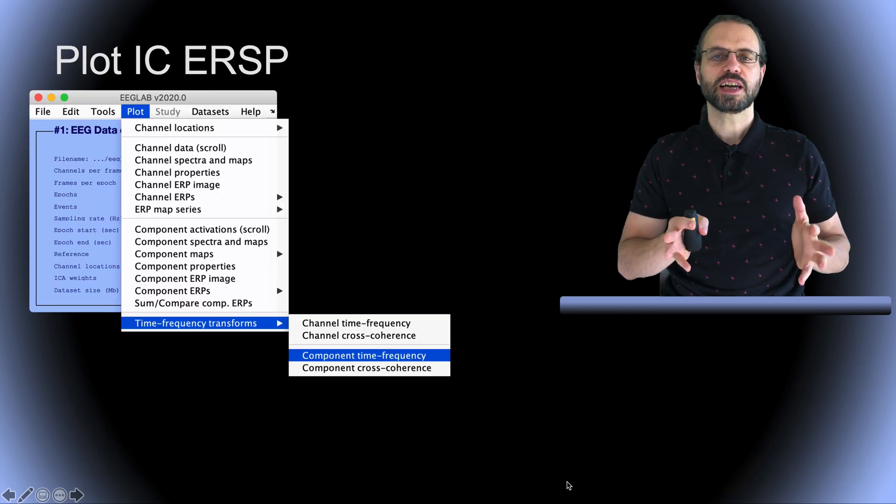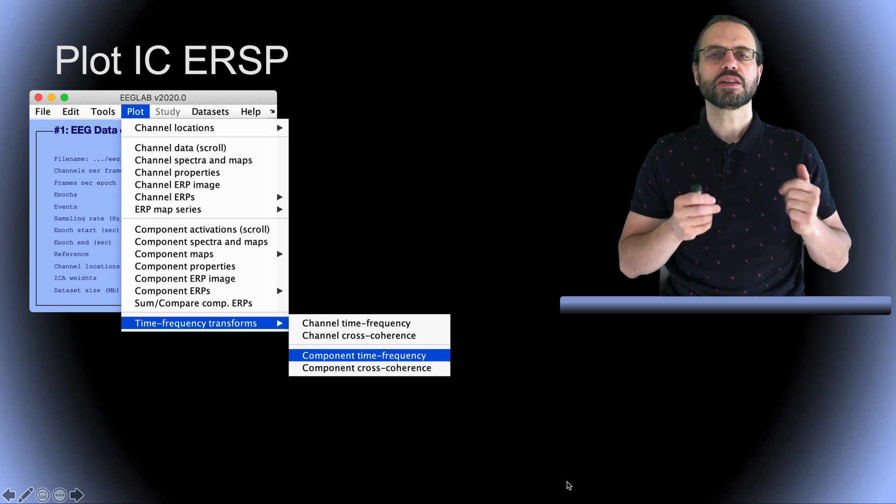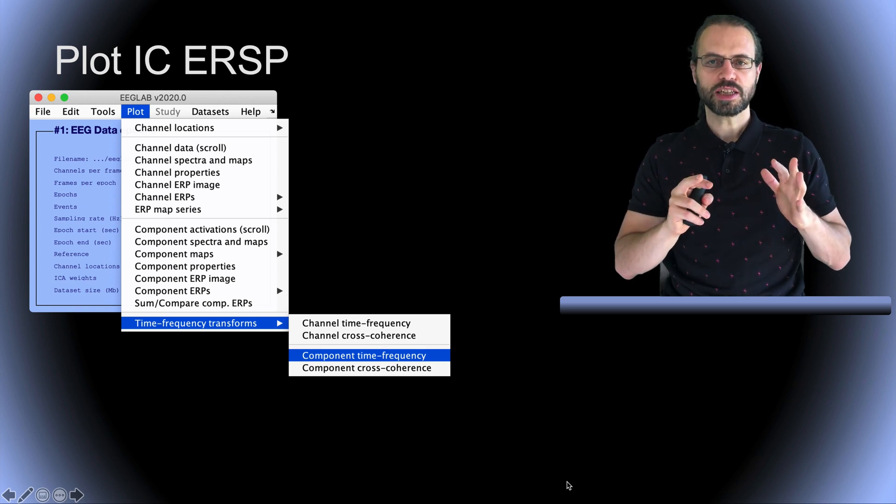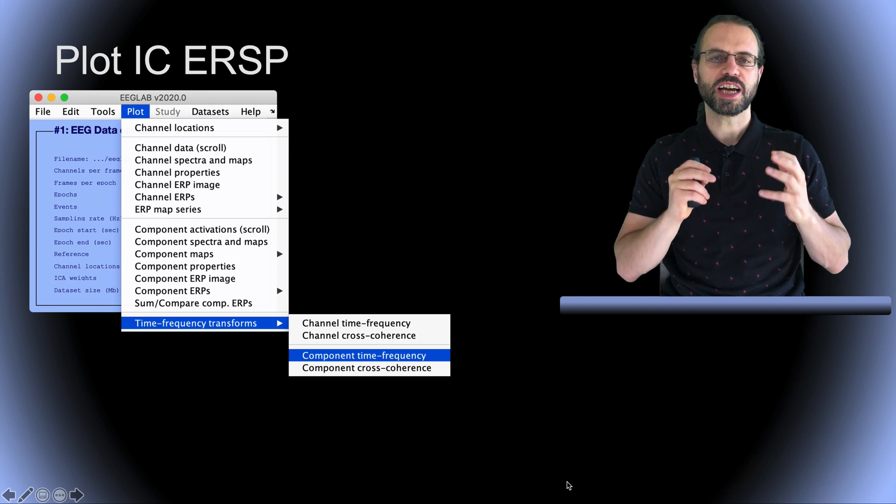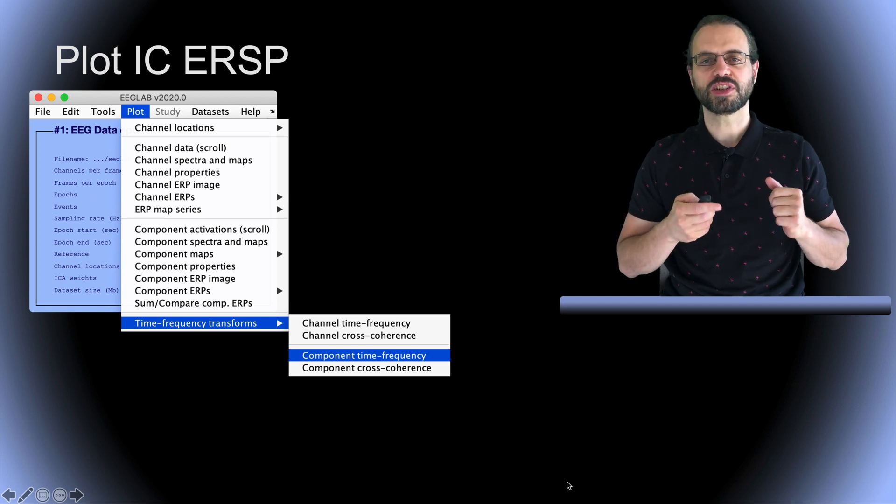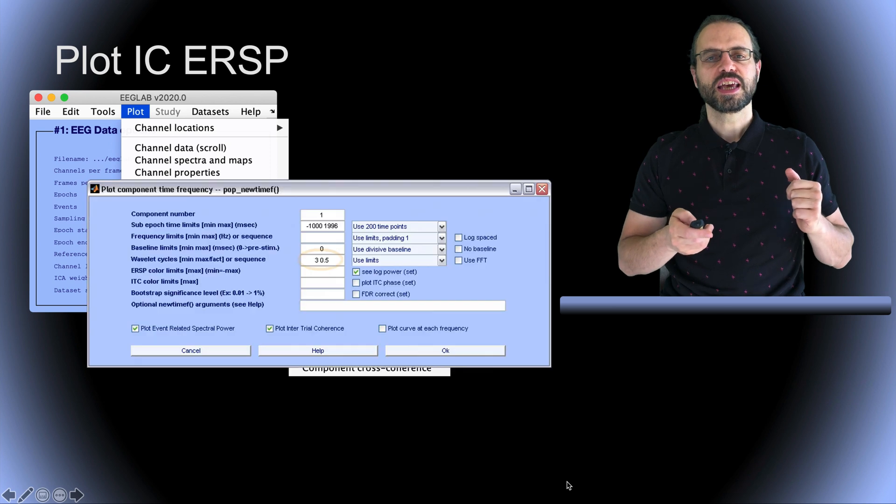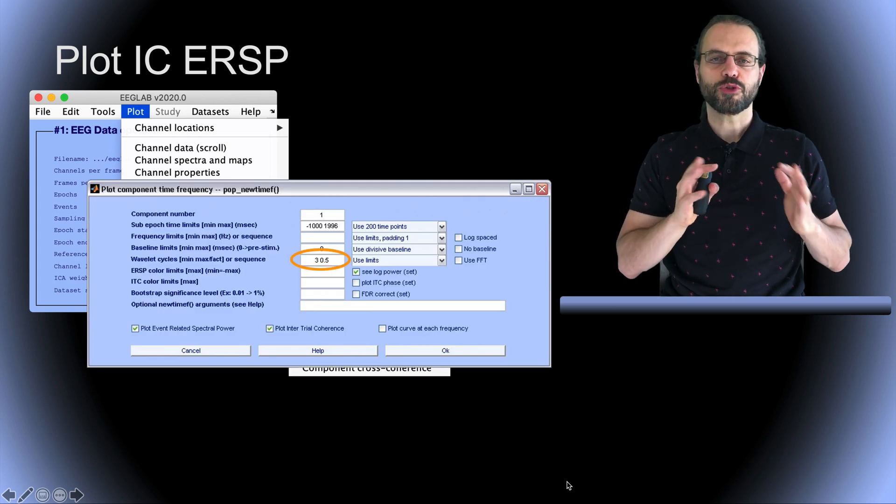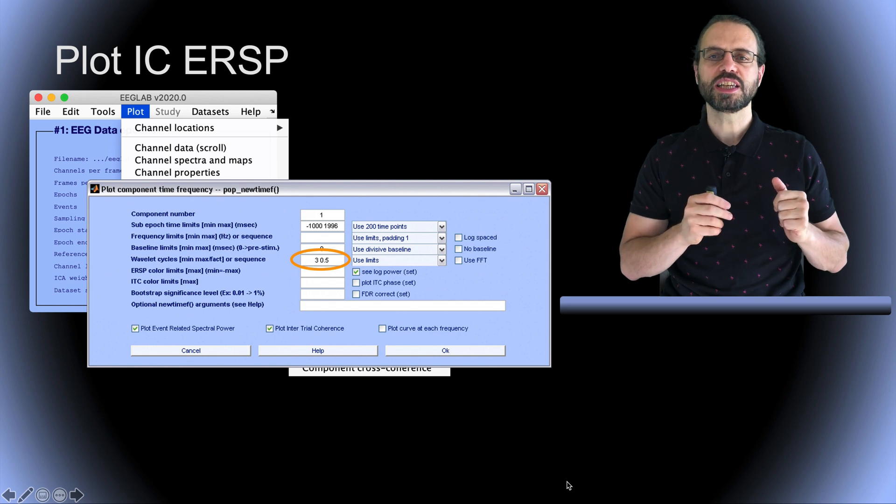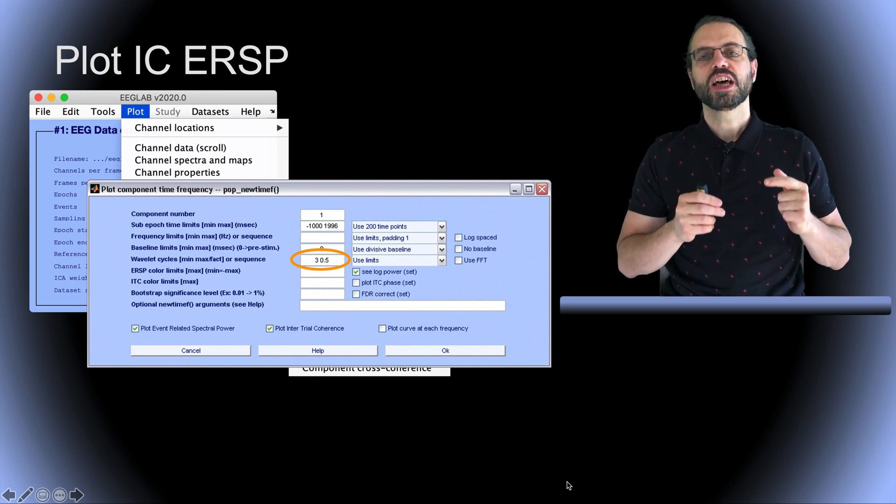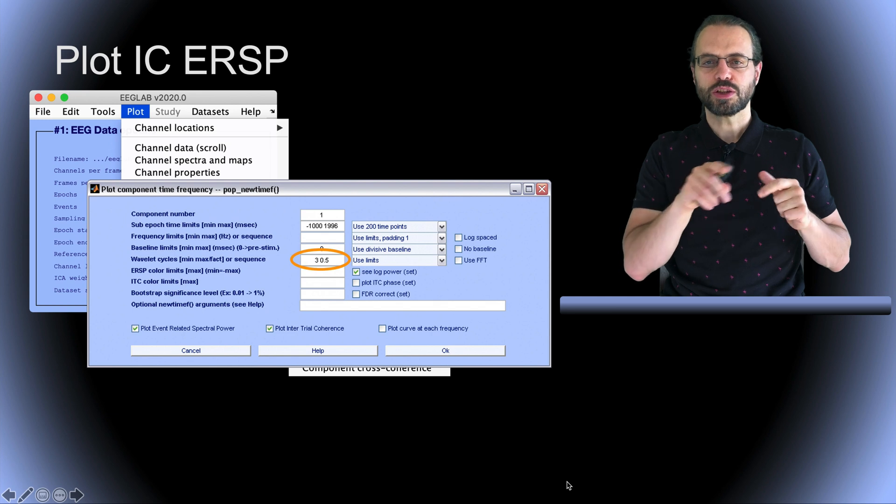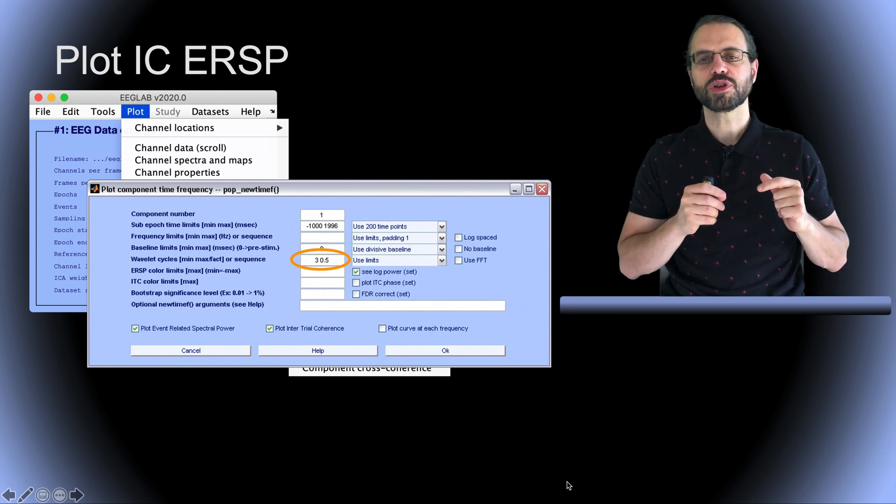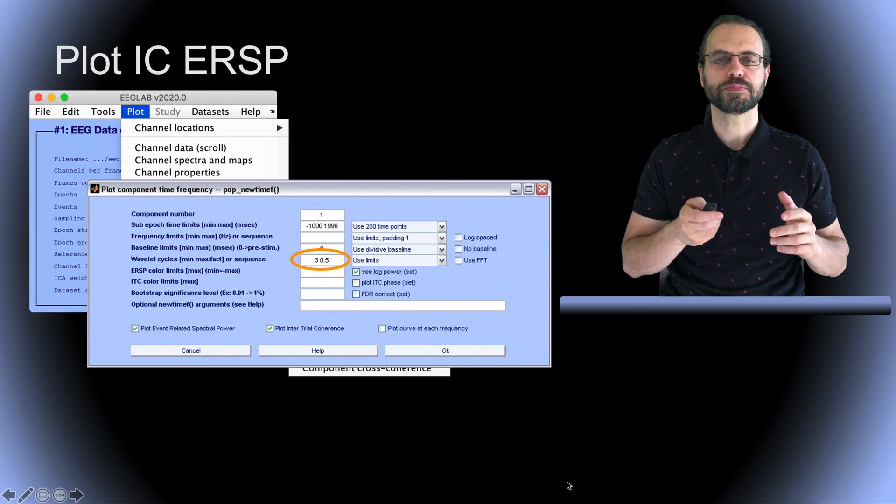On this slide, we're going to plot a time frequency decomposition. Here we're plotting the time frequency decomposition of an ICA component, but you can plot time frequency decomposition of data channels as well. In this case, the default is set to using three cycles per wavelet at the lowest frequency and a scale expansion factor of 0.5. On the same row where you select the wavelet parameters, you can instead select Fourier transform by checking the checkbox.